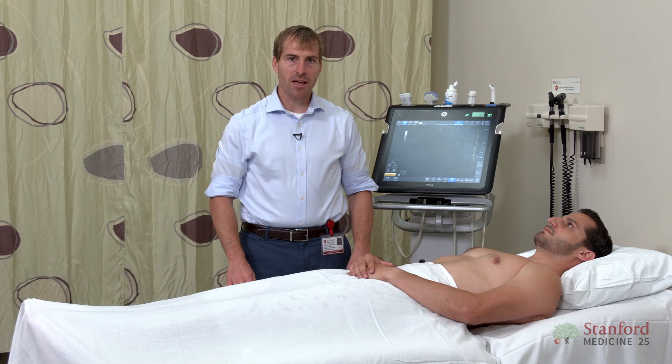Hi, I'm Dr. John Kugler with the Stanford 25 Ultrasound Series. Today we're going to get started with our first ultrasound scan.